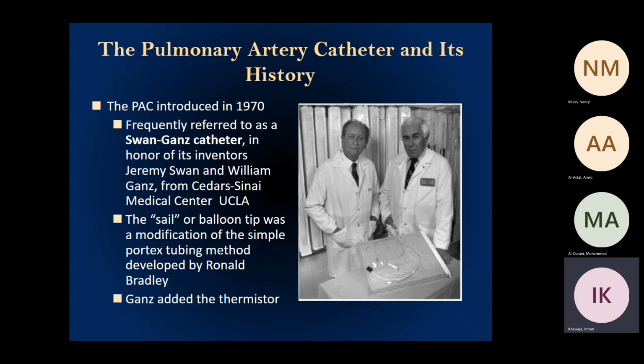Clinical use of the PA catheter goes back to 1970. You will hear different terminology: PA catheter, right heart cath, Swan-Ganz catheter, all the same. Swan-Ganz refers to the two physicians from Cedars-Sinai and UCLA, Dr. Swan and Dr. Ganz, who invented the PA catheter for clinical use.